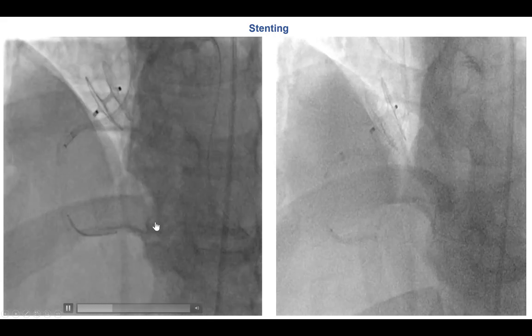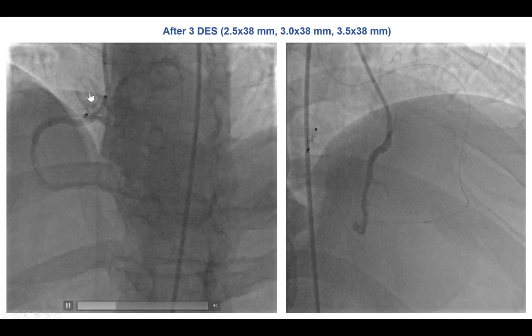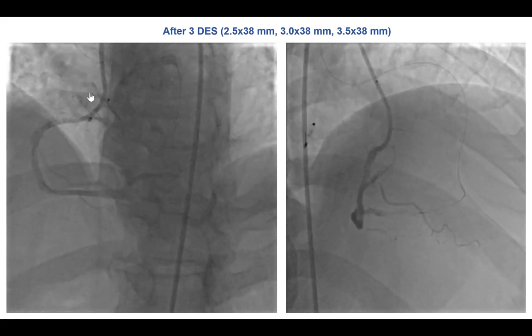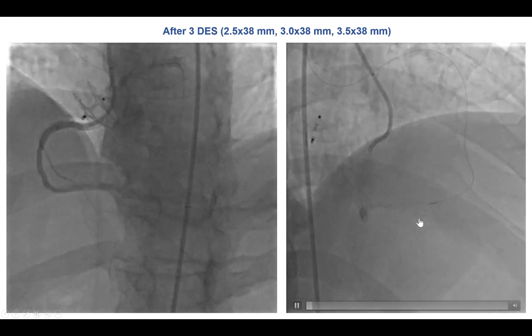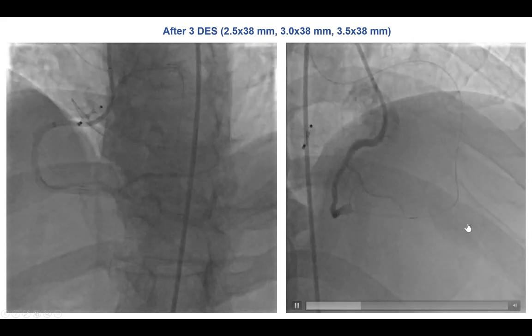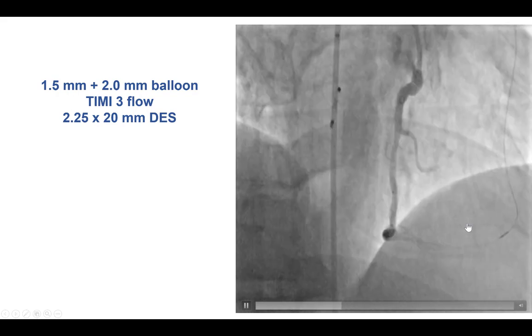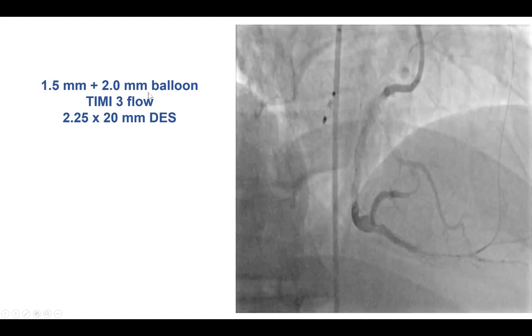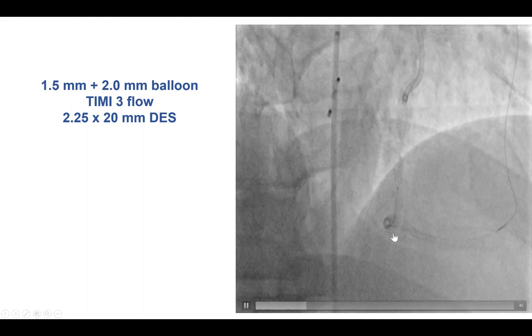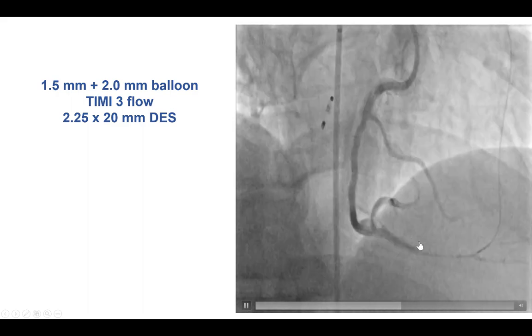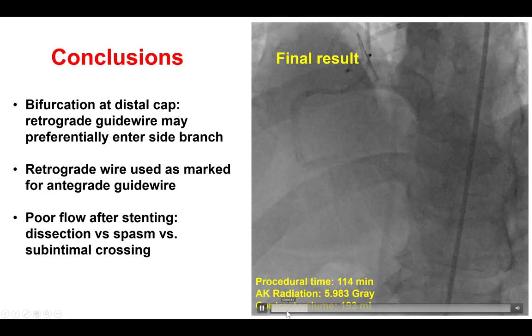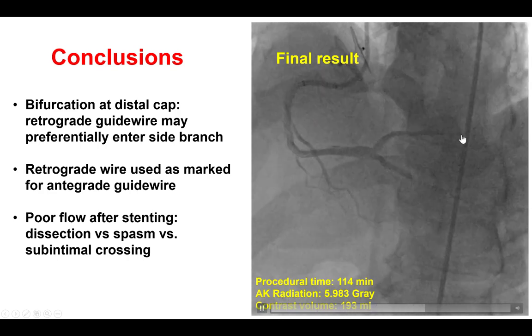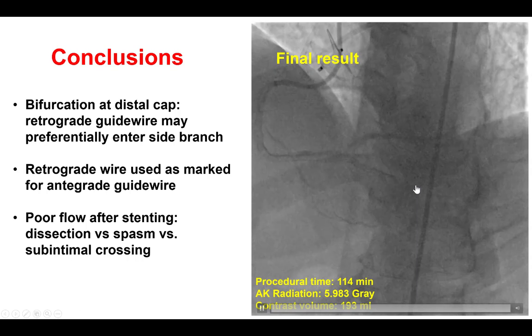We placed multiple stents all the way from the PDA into the proximal right coronary artery, and that seemed to restore antegrade flow to the posterior lateral. However, unfortunately, there was very poor flow to the posterior descending artery. That is why we did some additional dilations with small balloons and ended up placing an additional 2.5 mm drug-eluting stent. That did restore TIMI 3 flow in the PDA and there was also TIMI 3 flow into the right posterior lateral branch.